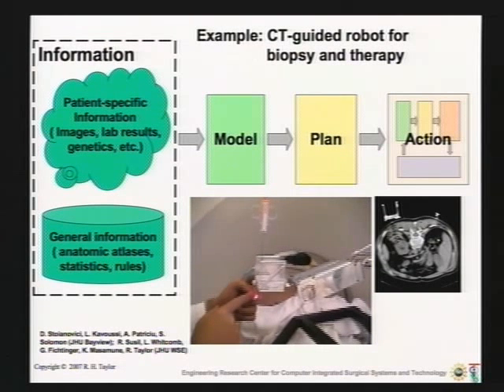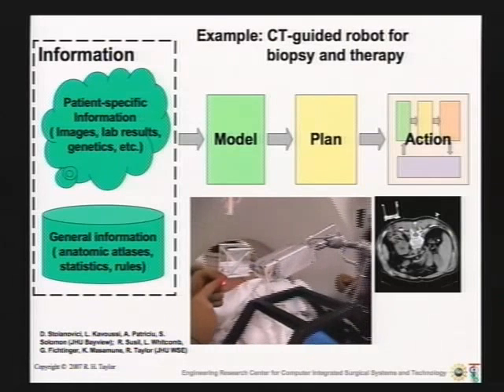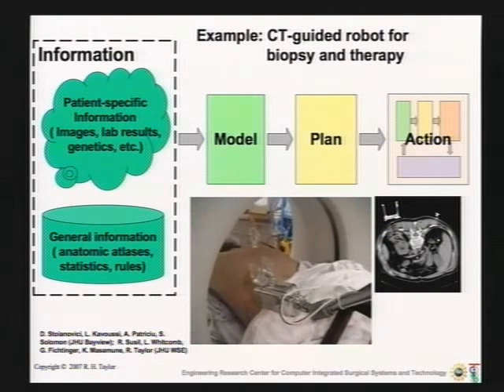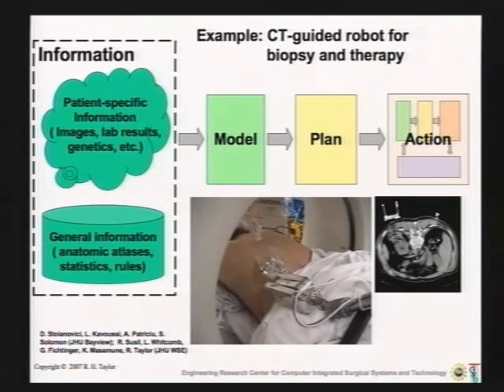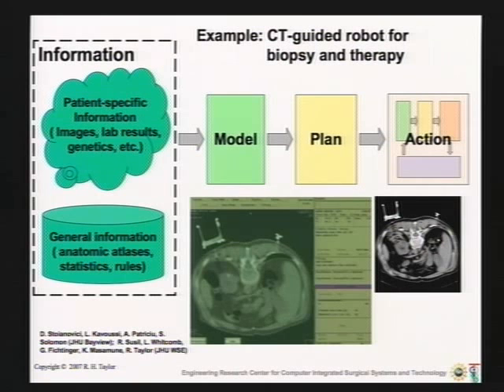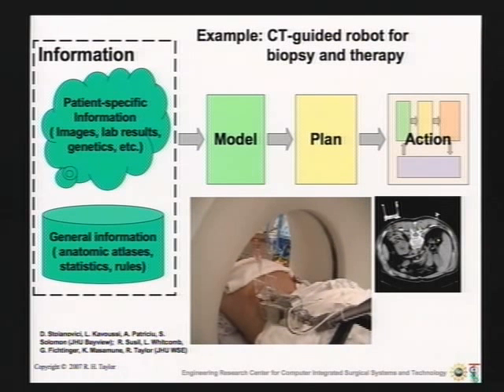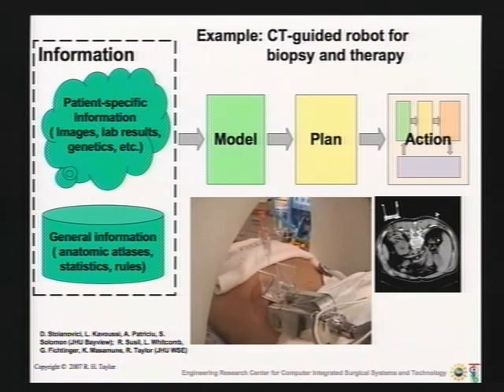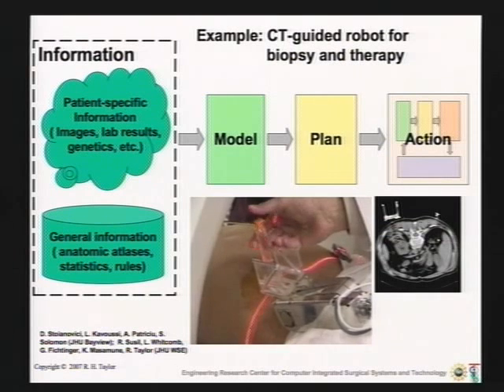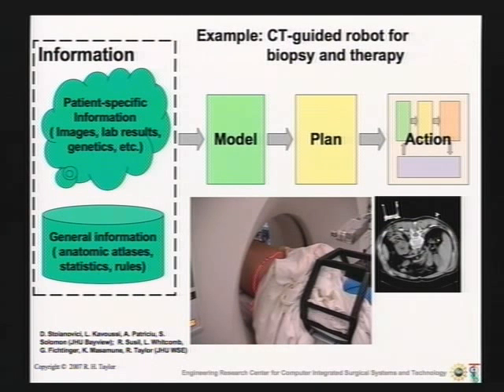Here's an example where the needle driver has a fiducial structure. This is equipped sort of similar to a BRW head frame. And what you do here is that from CT fluoro, from even one slice through that, we know exactly where the needle driver is. Now here we're biopsying this candidate tumor with the needle in plane. But if you can't see the needle in the image, you can still know where it is by analyzing that structure. One of the very important things is if you have an image for targeting and you can use the image to help you close your feedback loop, you're going to be a lot more accurate and have a lot simpler setup too.